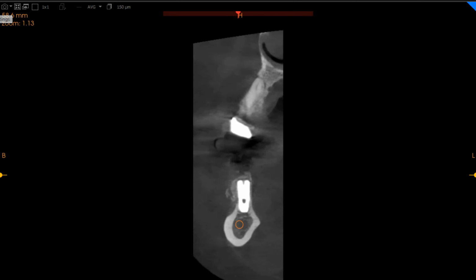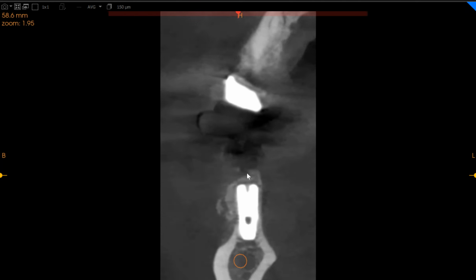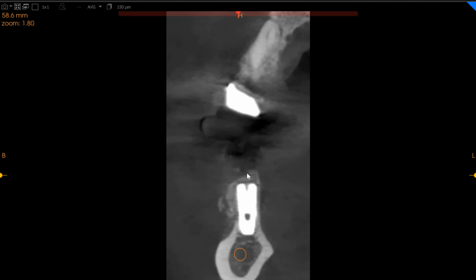As you can very clearly see, the implant is placed quite center of the ridge, and we can see it right here. There is considerable lingual plate present on this aspect, that you can see right here, and we've got a considerable graft present on the buccal aspect. So we've got the buccal aspect very well covered by the graft, and the implant at no point is exposed. Even though this was an extremely thin ridge, the implant is placed dead center with absolutely no problems here.